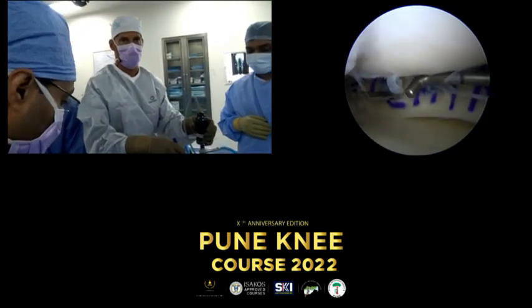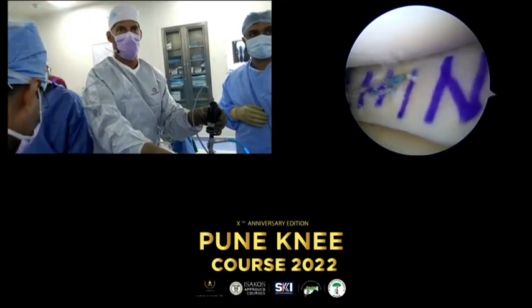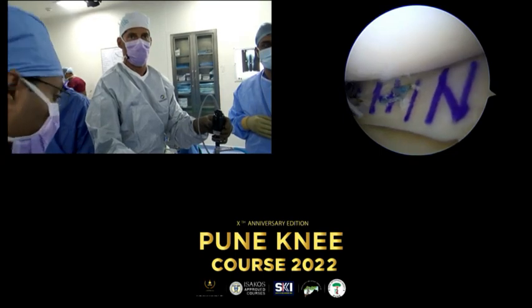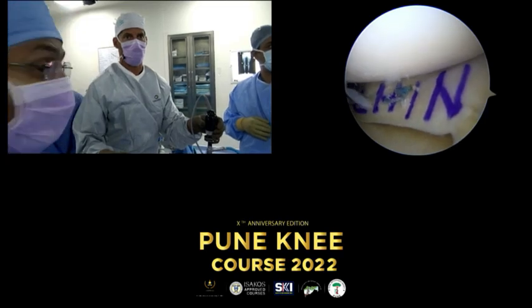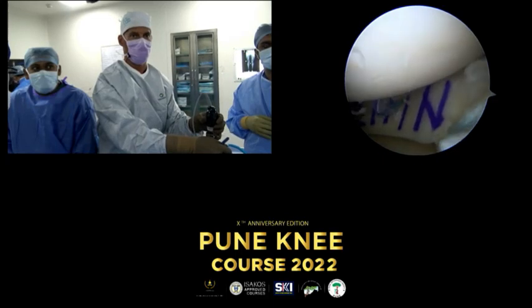Okay. Nagraj? Just like in primary meniscus repair, we give a lot of importance to the undersurface stitch for the restoration of the meniscotibial ligaments. Isn't it same important here also? Yes, he would probably put in a couple of sutures on the underside as well, once he's done with the top side sutures, so that you have a good restoration of the whole meniscus.